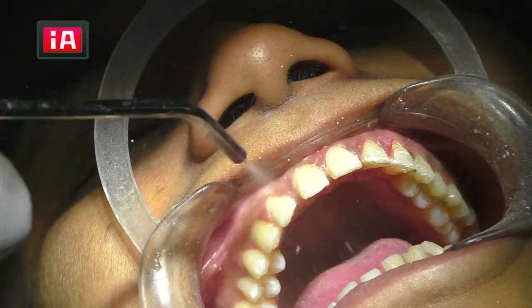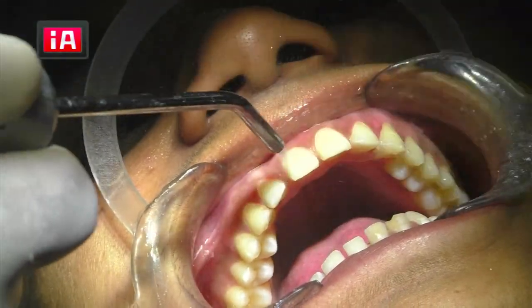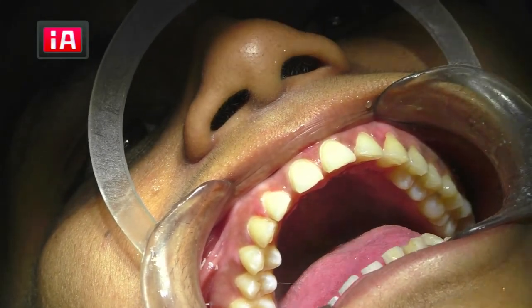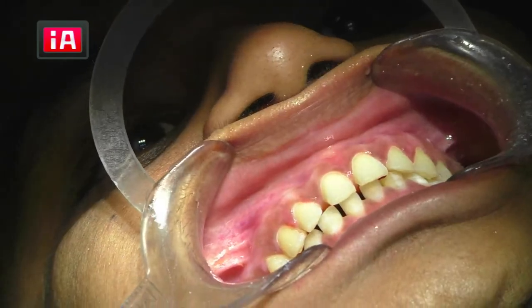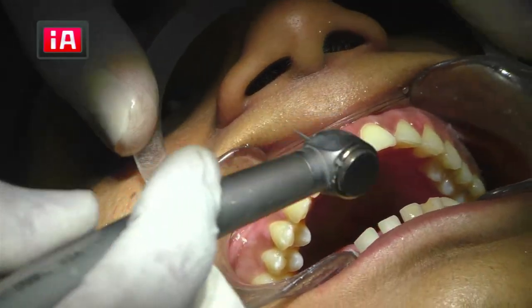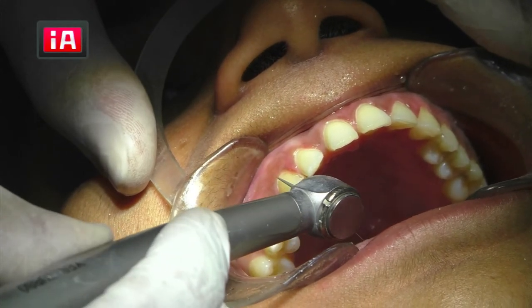Last stage, finish it with the finishing bur, the yellow band bur, a very fine finishing bur. Just finish it smooth from canine to canine. That's it. That is the end of our preparation. Open. Then I'll show you how to scan.